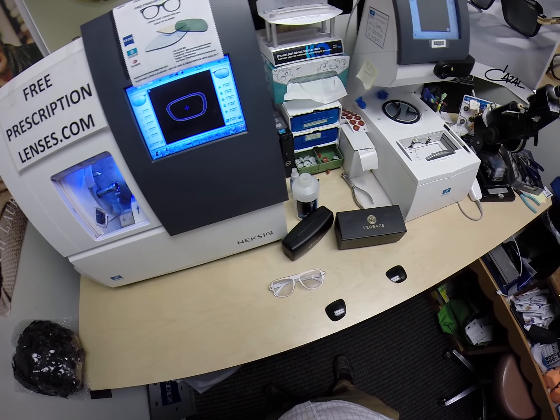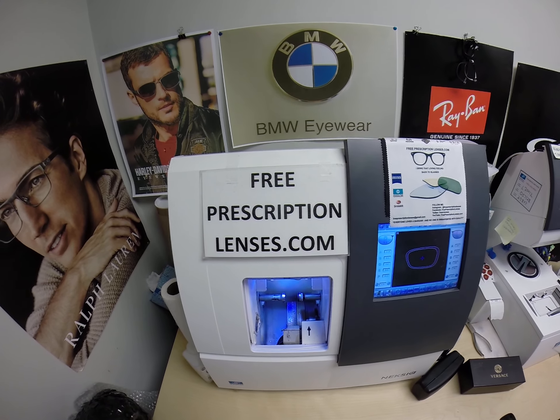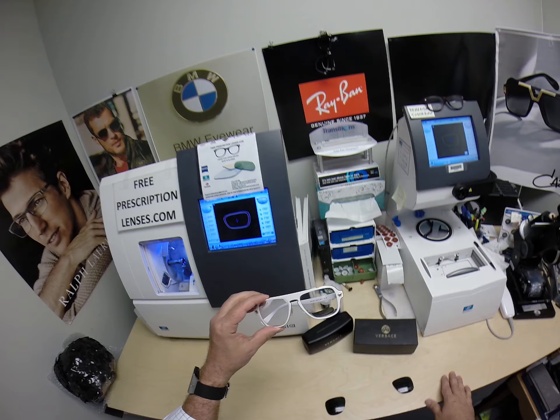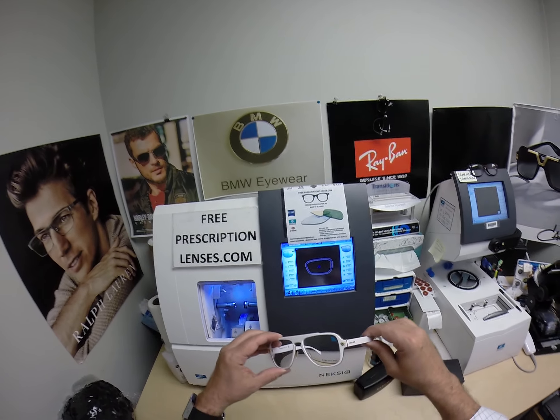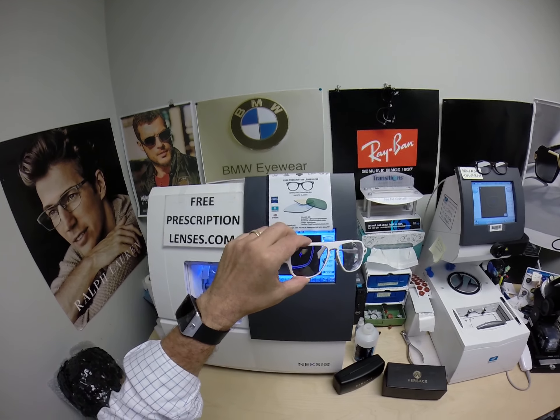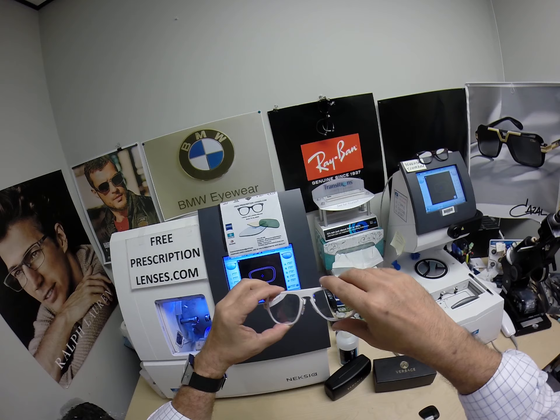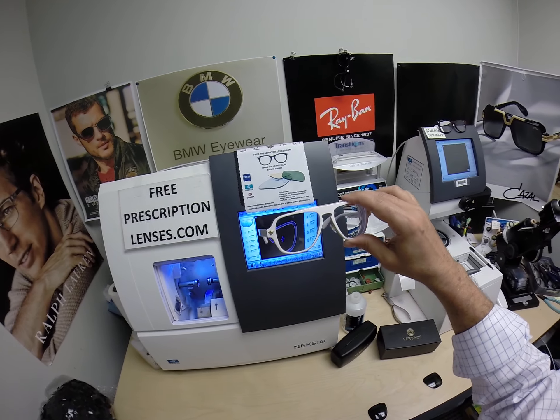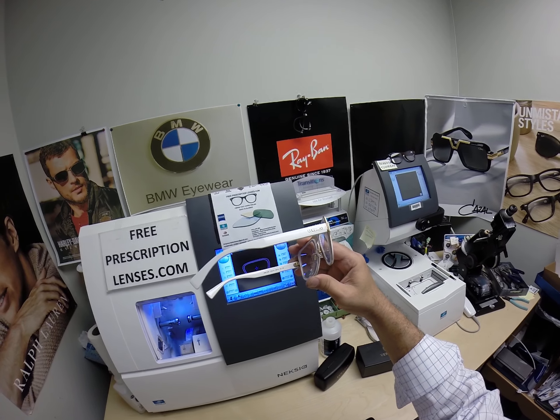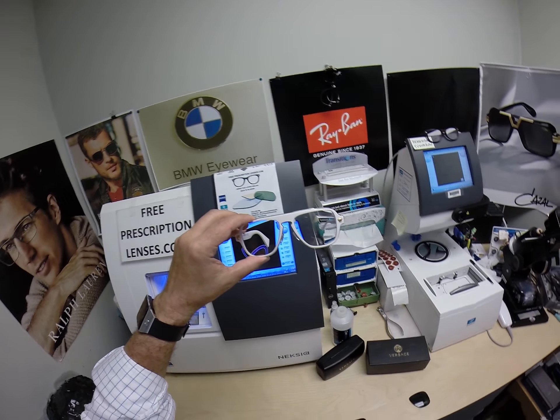Hello everyone. Today I want to show you the Versace 2199. This is freeprescriptionlenses.com, where everyone loves a bargain and no one is disappointed in quality. You buy any frame I offer and you'll get one free pair of clear single vision prescription or non-prescription fashion lenses. I'm the hardest working optician in the industry. My name is Seymour Better, but call me Moe Moe Better, because I'm going to have you see a Moe Better look.